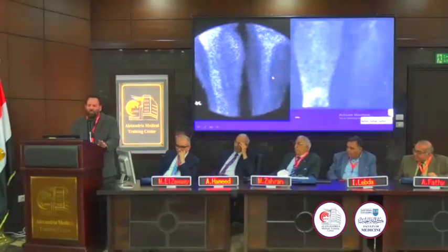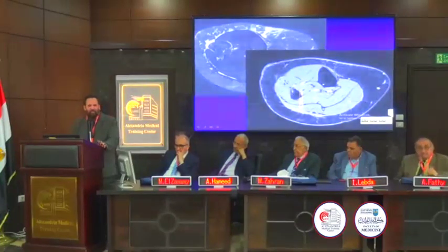Cellulitis will usually be occult on indium. Fasciitis will be positive on indium. And on MR, you see the fluid in the fascia and the enhancement of the fascia. So the fascial involvement, as you would guess, distinguishes cellulitis from fasciitis.